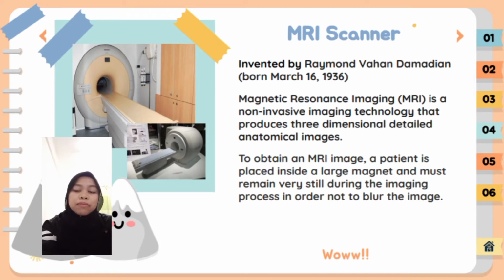Magnetic resonance imaging (MRI) is a non-invasive imaging technology that produces three-dimensional, detailed anatomical images. It is often used for disease detection, diagnosis, and treatment monitoring.